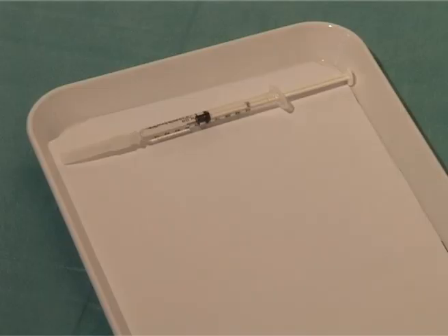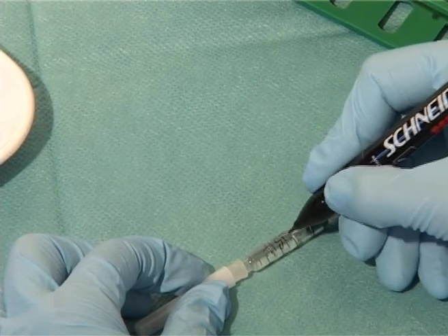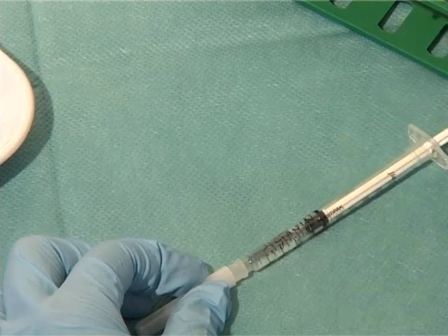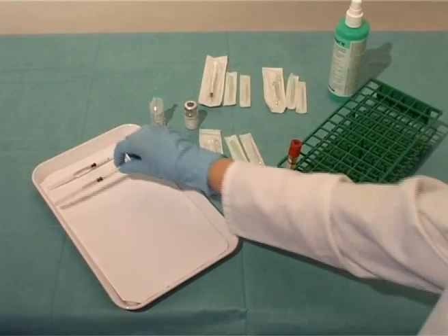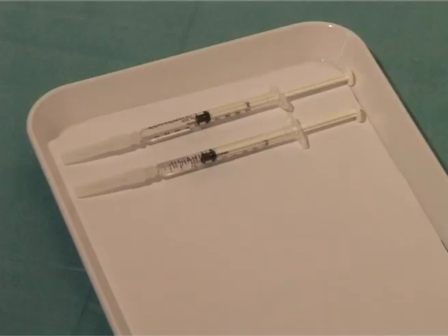Then, the positive control injection is prepared. About 150 to 200 µL of histamine solution should be drawn. The histamine solution should be suitable for intercutaneous testing and should contain 0.1 mg per mL of histamine.